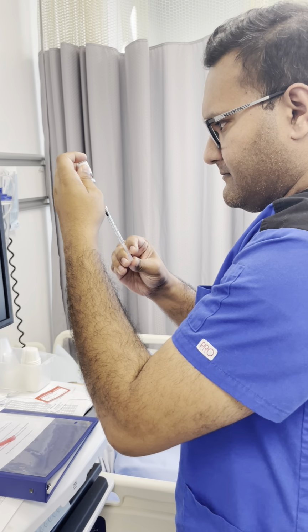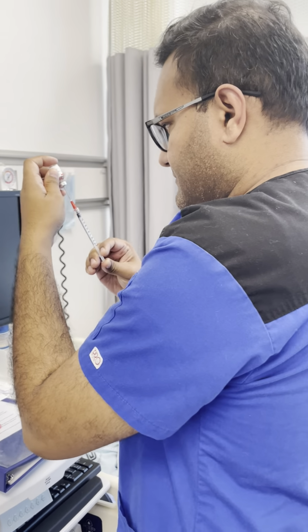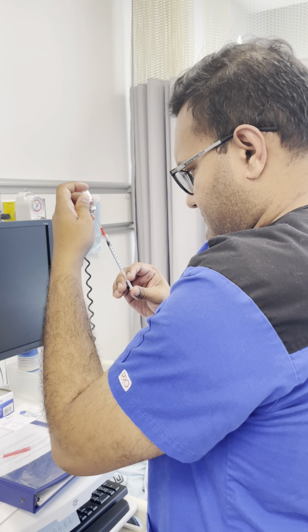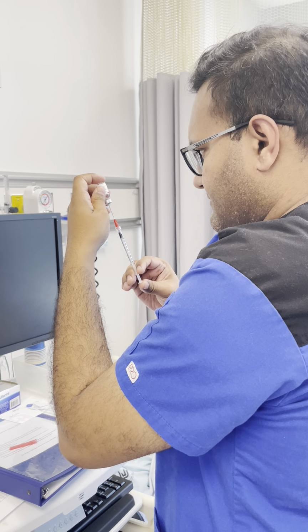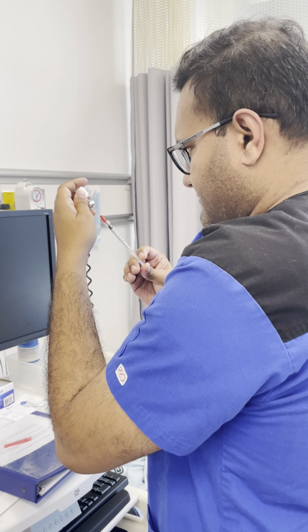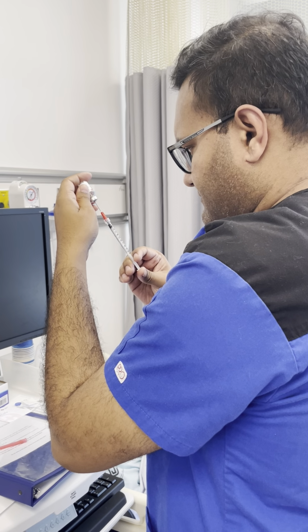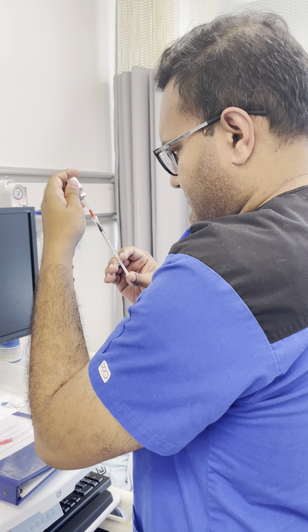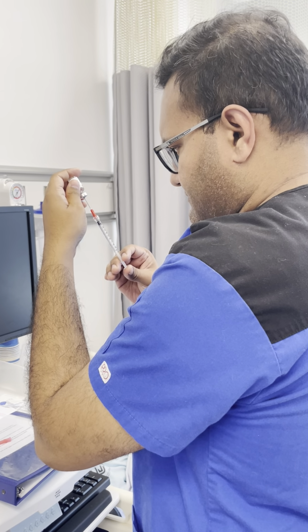And then I'm going to put on my red stopper, which is going to be the second technique. Like so, and then I'll put that from there. Go all into the garbage. And then I'll be getting into the patient's room.